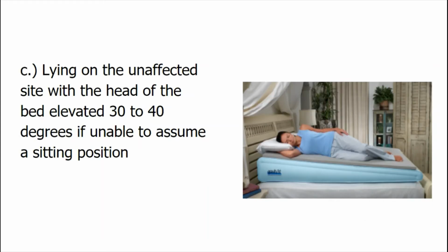Third, we have lying on the unaffected side with the head of the bed elevated 30 to 40 degrees if unable to assume a sitting position. This is for adults if they find it tiring to be sitting in a chair.